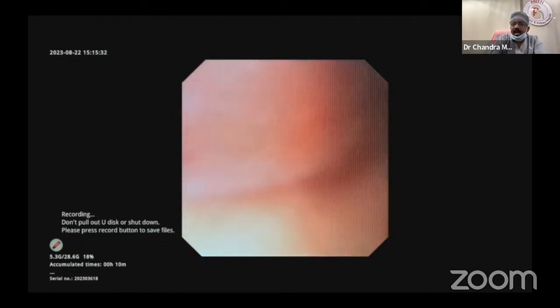Now, the last part of the discussion is whether to put a stent or nephrostomy. What will happen if the stent is put? The patient will go nicely. He will have some frequency and urgency, but after 12 days, you have to give anesthesia in children to remove it, a 5-year-old child. Whereas if you put a nephrostomy, it will drain the kidney for 1 day, with no contamination, no fever. After that, you clamp the nephrostomy for half an hour, then open and remove it, so that the ureteric catheter will be there for 1 day, so that the ureter will be technically open and stent removal can be avoided. That's what exactly I did.